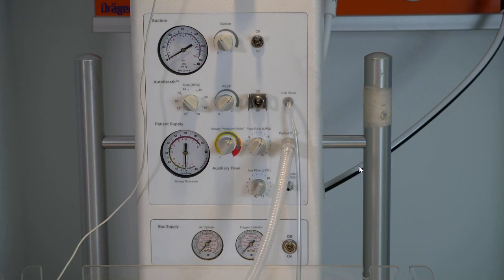It would be a very good way because, as I tried to explain, in next month's lecture we cover barotrauma quite extensively. This method of resuscitation is controlled, and it shows us the pressure. So at no stage can we overshoot that and cause barotrauma, atelectrauma, and volutrauma to the lung. So for me, this would make far more sense. Excellent. Thank you, Linda. Another question.